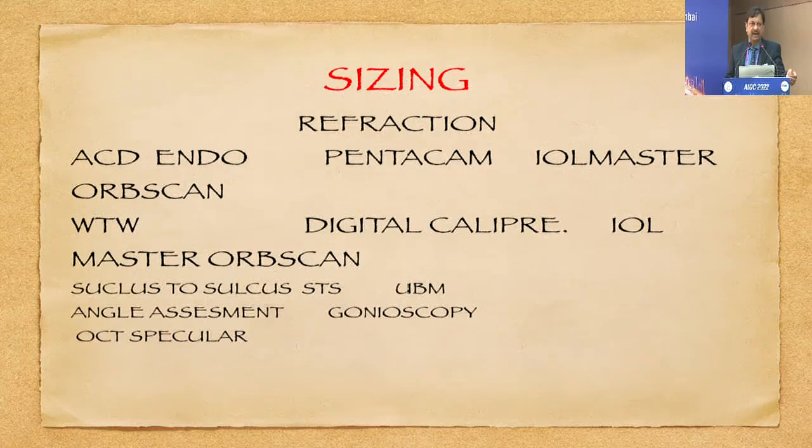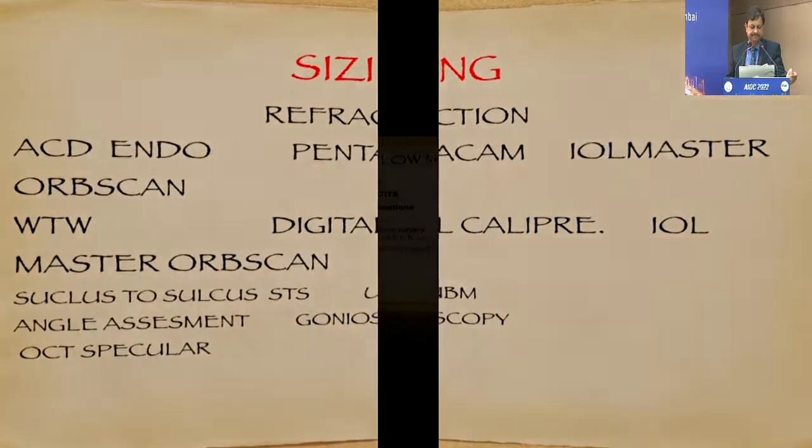So this is one key factor where, as refractive surgeons, you should never ever compromise on the anterior chamber depth measurements. Different equipments have different calibrations, but what we use is the Pentacam, which we believe is the gold standard for measuring the anterior chamber depth. And white to white we use the digital calipers, though whenever you are in doubt you can take the readings from different equipments, the IOLMasters or the Pentacams, but what makes me feel best is the white to white on the digital calipers.